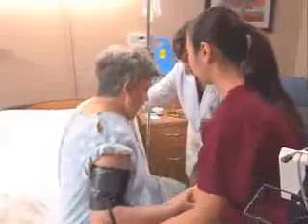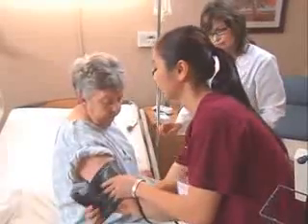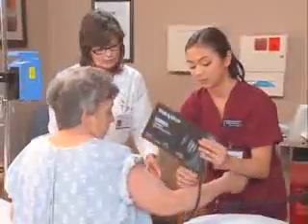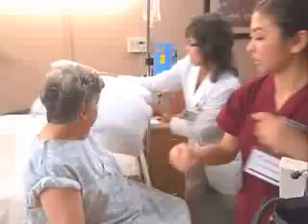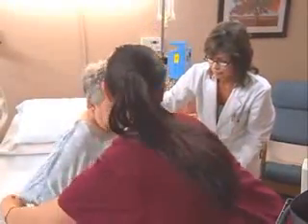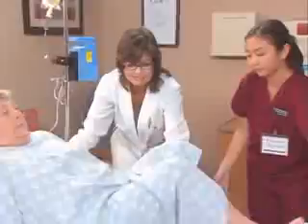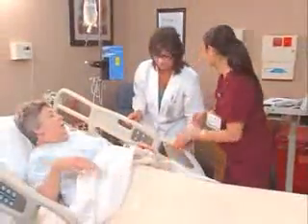Good. All right, let's get this cuff off. Okay. And I'll take the pillows and we'll put them back where they were. There we are. Good. Great.